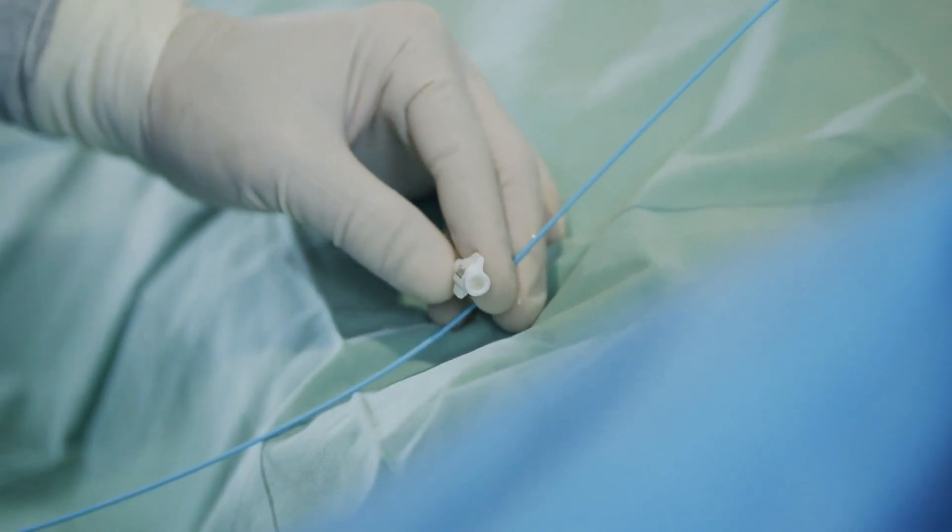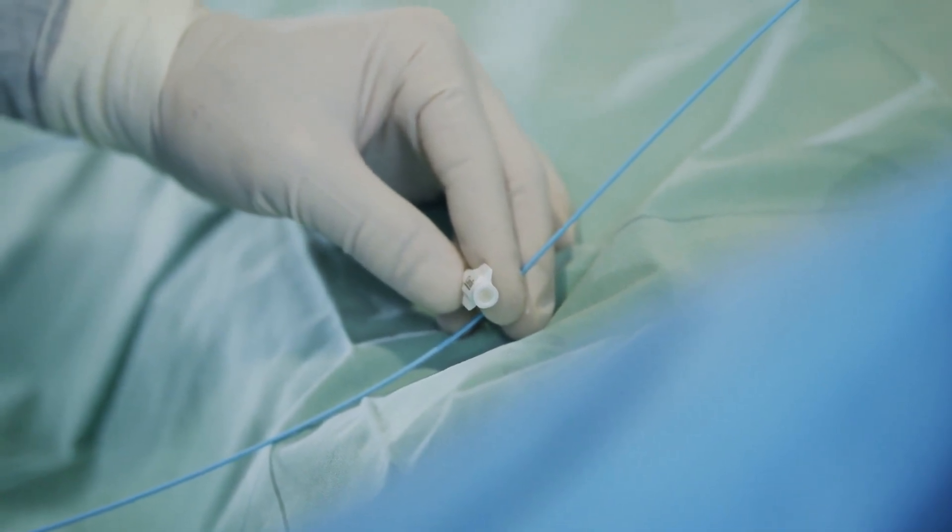You probably think — is there a stent actually there? The crimping process actually means that the stent can be compressed down to make it as thin as possible so we can deliver it through our catheters. The catheter we normally use is about two millimetres in diameter, so we're talking about very small catheters. You can imagine if we have to put a five millimetre stent through a catheter that's only two millimetres in diameter — the stents are crimped, compressed after they're manufactured onto a balloon. That crimping process shrinks them down to allow us to pass, say, a five millimetre stent through a two millimetre tube, and then expand it to five millimetres inside the artery.